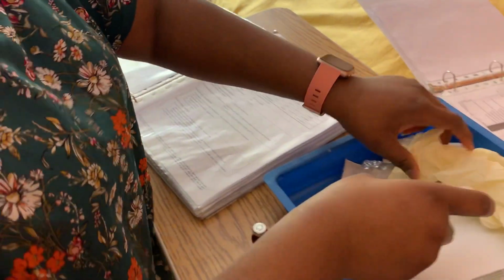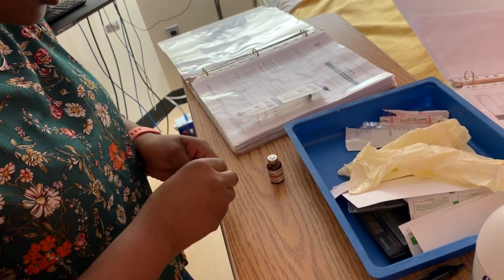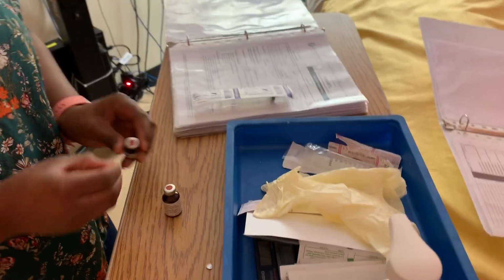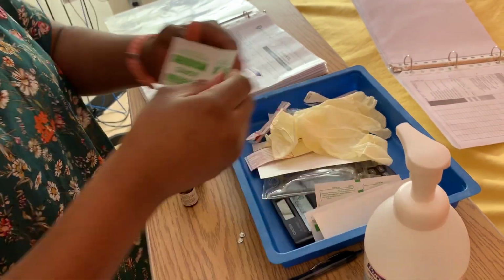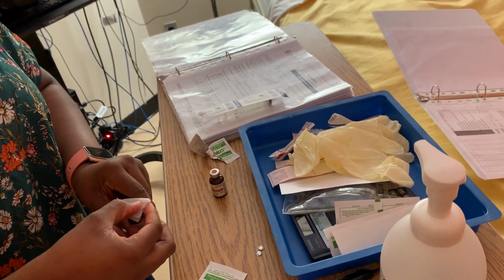So first I'm gonna get this, or I can open it up. And I'm gonna alcohol swab it. Alcohol swab for 30.